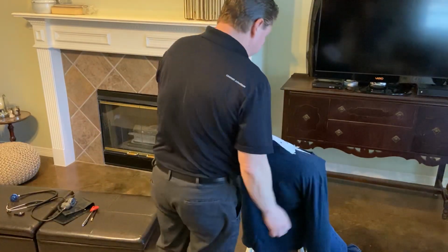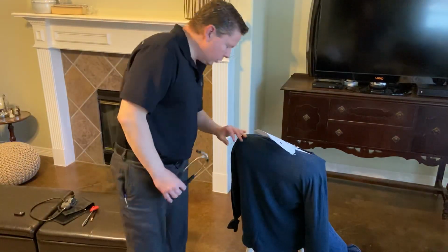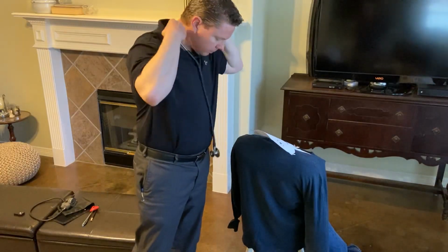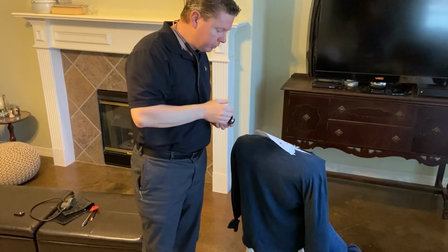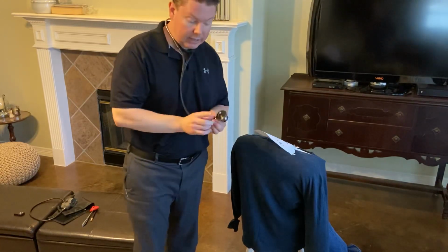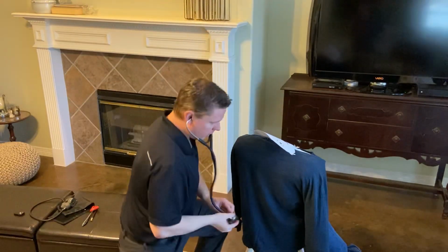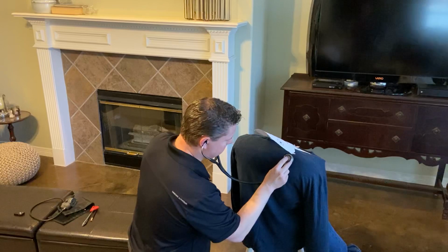All right. Finally, we're going to listen. I'm going to listen to your breathing, okay? I want you to go ahead and clear your throat for me. Every time you feel this stethoscope on your back, I want you to breathe in and out through your mouth. Let me know if I'm going too fast. Again, stethoscope has to be on the skin for this. In and out through your mouth, please.